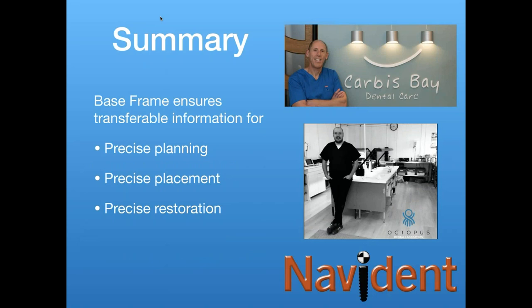So in summary, the base frame ensures that we have transferable information for precise planning, precise placement, and precise restoration. And it can also save a lot of time when we come to do the permanent bridge a few months down the line, as we already have the working model. All we need is a soft tissue update, and we have the implant analogs in the model ready to go for the next stage.